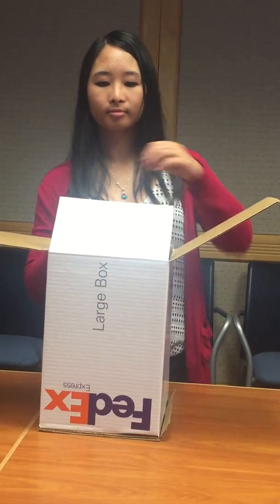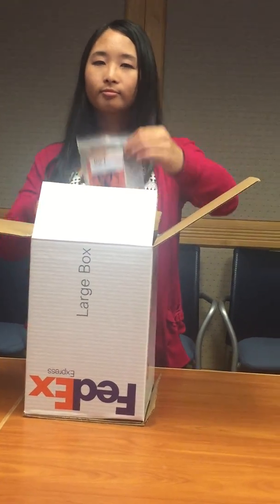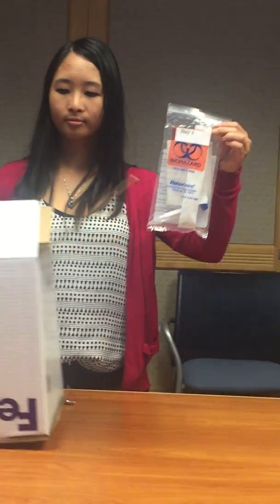Wash hands before collecting swab. Blow nose if needed. Open self-collection kit and place all supplies on a clean, dry surface.